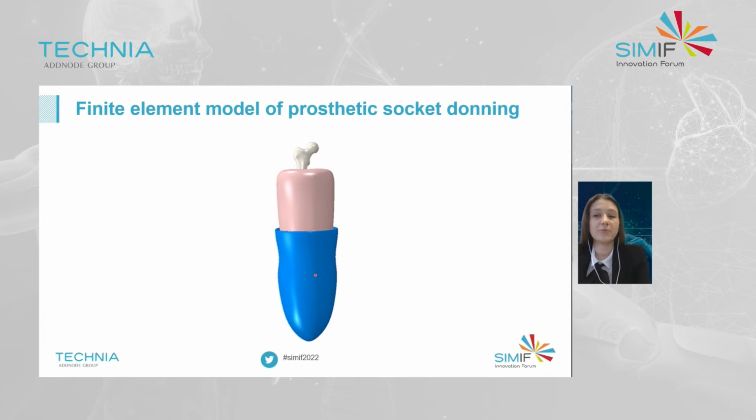Socket donning applies press stresses to the residuum tissues. The key issue during simulation is to resolve the difference in the shapes between the limb and the press fit socket. So in this presentation, explicit donning is simulated. The socket is moved into a small initial contact with the limb, and a small overclosure step is resolved to give numerical stability, and it's followed by sliding the socket onto the limb and calculating generated interface stresses.